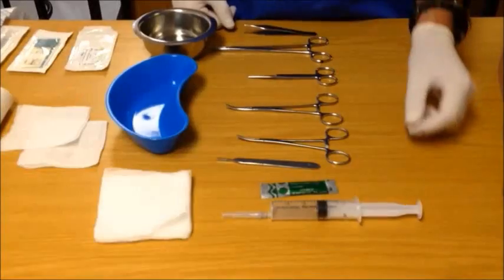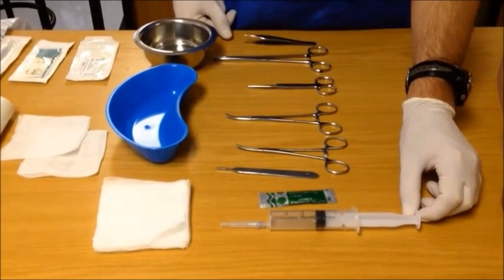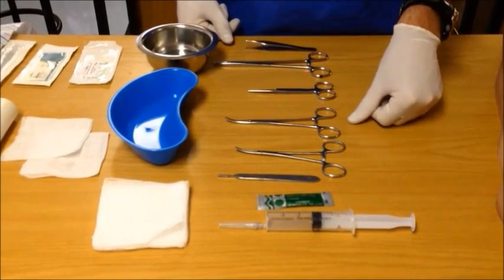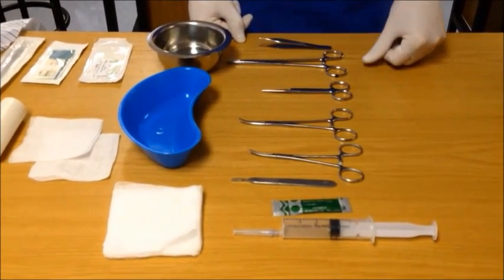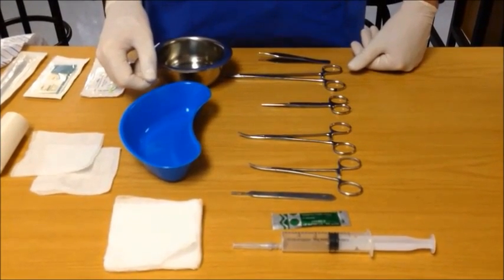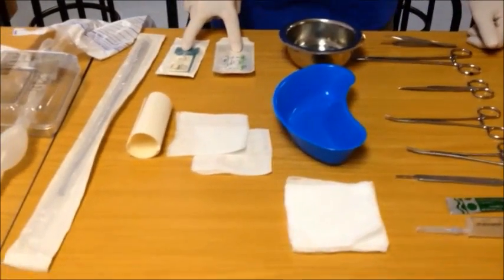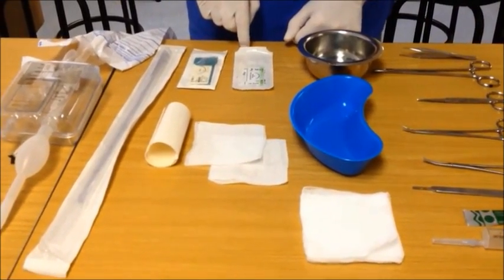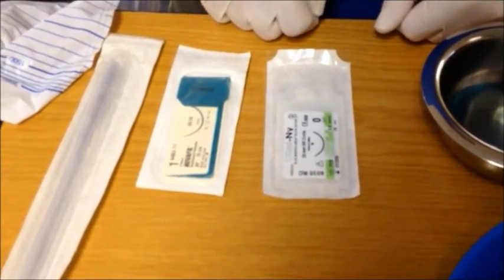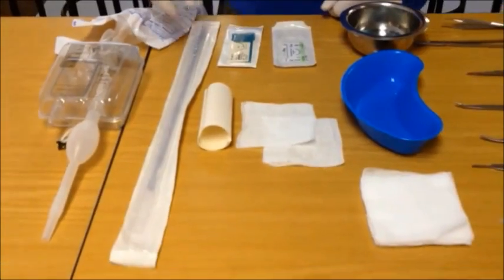Let's talk about equipment. You are going to need a local anesthetic — calculate the maximum dose and be liberal in how much local anesthetic you use. You will need a blade and a surgical blade handle if available, two curved artery forceps, a pair of scissors, a needle holder and forceps. You should also have cleaning solution for the skin and a receptacle for contaminated equipment. Make sure that you have gauze available and sutures — we recommend a monofilament suture which should be at least 50 mm long with a thickness in the range of 1-0, 0, or 1. You should also have some adhesive tape.